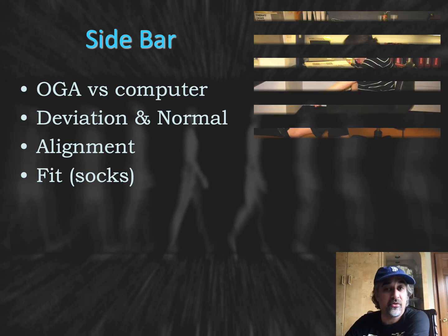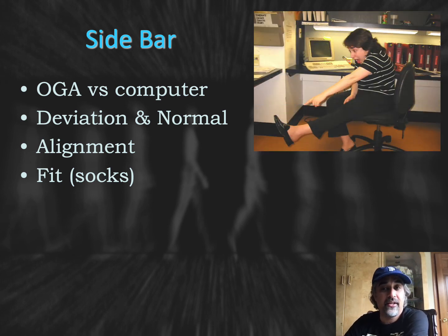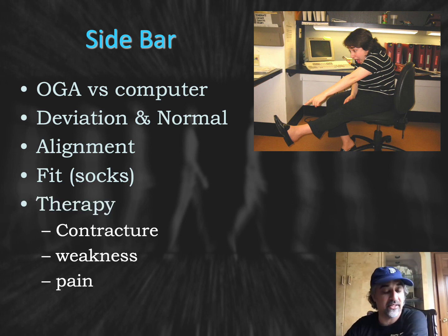and usually my mentor, Dr. Eleanor Annan, kind of proved to me in her clinic that 95% of the time it was an issue of sock management. They weren't either putting adequate number of socks in or not watching how their shape was changing and needed more socks later, or maybe they were wearing too many. And then you can address a lot of this stuff in physical therapy by addressing flexibility, contracture, weakness, pain, and just fear by doing a lot of training.